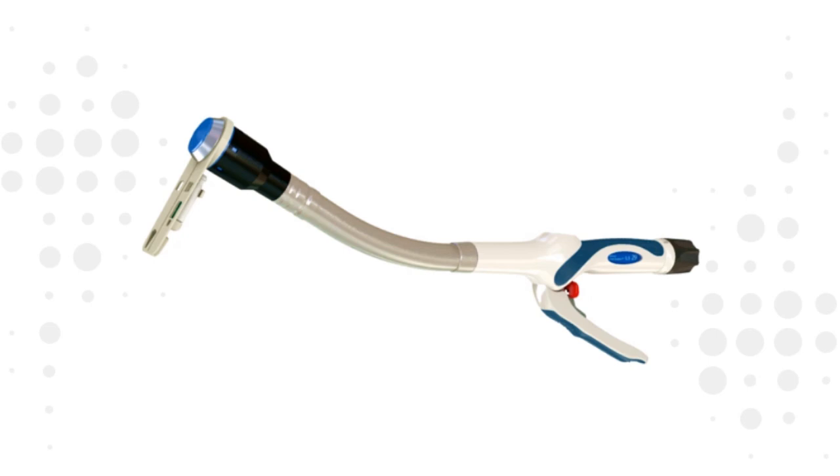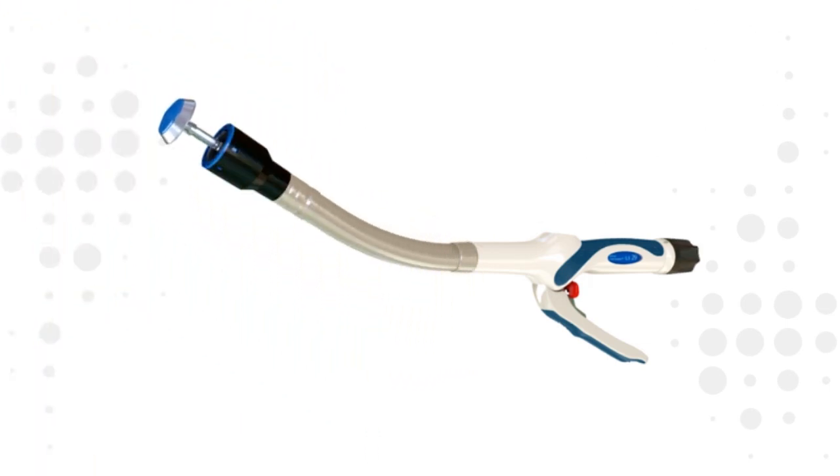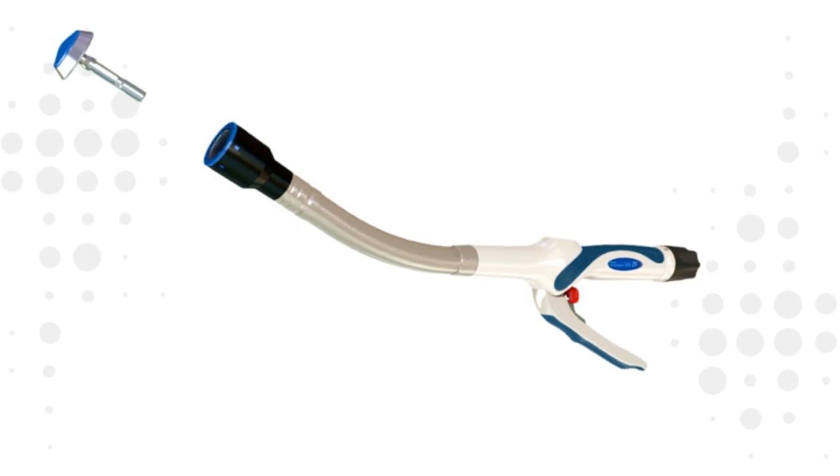Open the device by rotating the adjusting knob counter-clockwise and carefully remove the accessory tray. If the green ancillary trocar tip is to be used during the procedure, ensure that it remains in the sterile field. Remove the anvil and retract the trocar fully by rotating the adjusting knob clockwise.